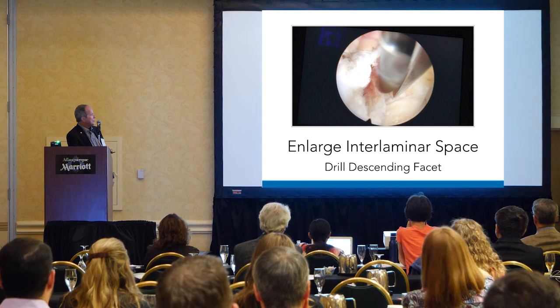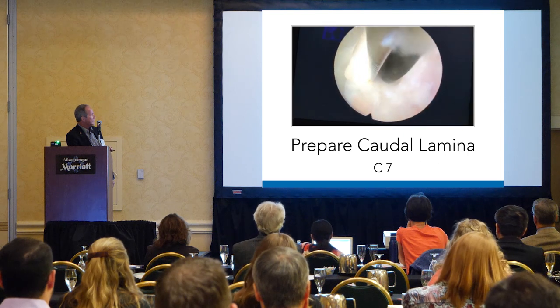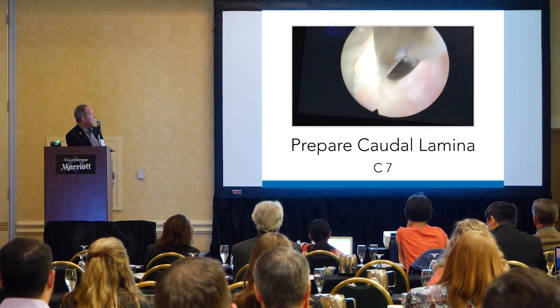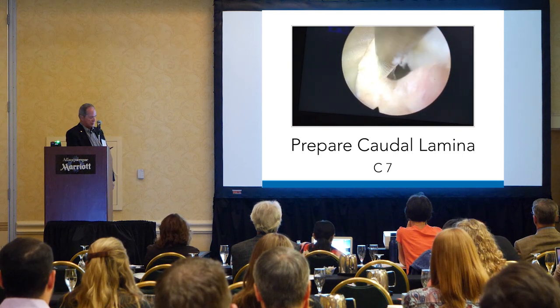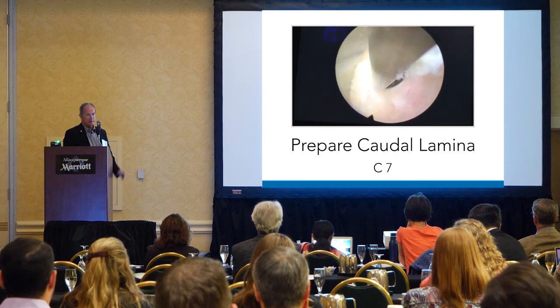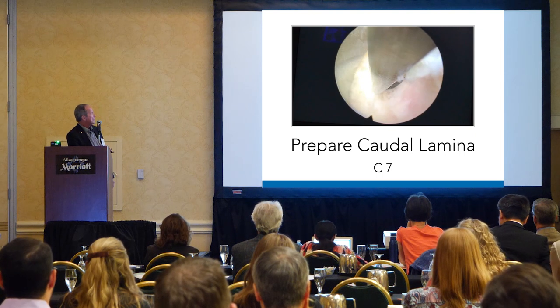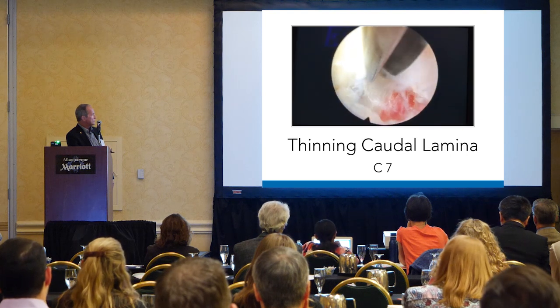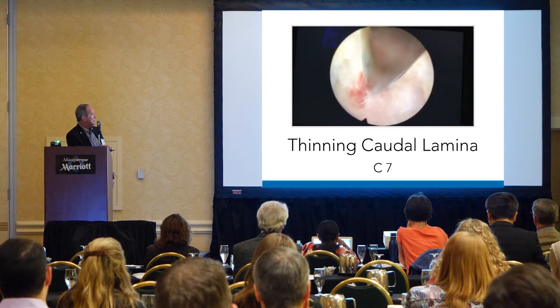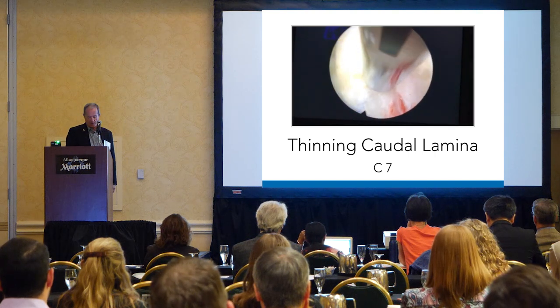Okay, now we're going to be preparing the caudal lamina, lamina of 7. So there it is right there. You can see that we're using the burr. We're really right in the middle of the interlaminar space, and we're trying to prepare it distally and come lateral. Now we're going to be thinning it more with the oval burr. That's what we're going to start with first. So this is good to make some headway going caudal.